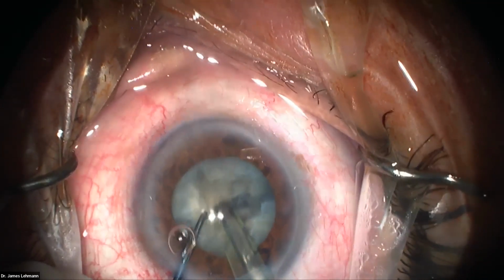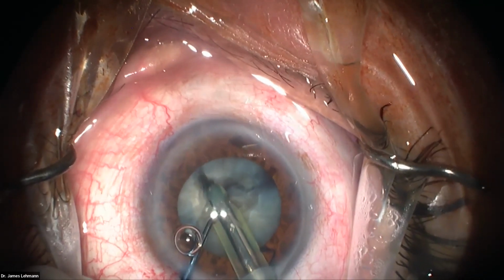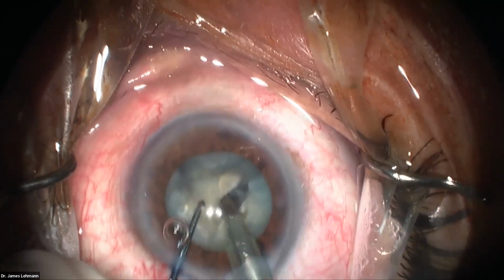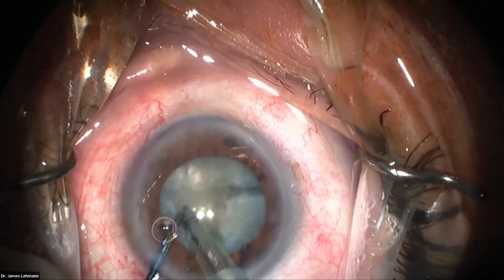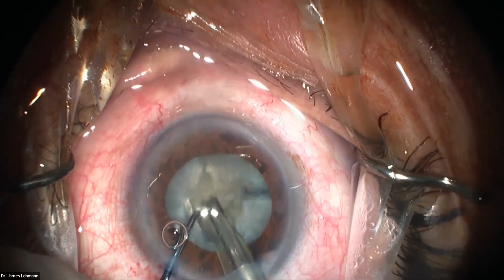That's a real, and we're going to go down to that same depth. Okay, so we're good. We're almost at that same depth. Now it's easy to get that next piece. Then I'm just going to keep on moving. Now I'm moving to the next quadrant. Very methodical. No excessive movements. Now we're just going to do the same.